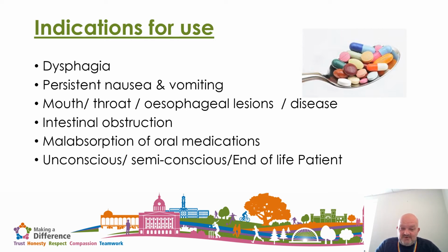And obviously, for a lot of us, we come across syringe drivers for patients at the end of life, where again, they are unable to swallow due to weakness or some physical issue that's stopping them from swallowing their medication. But usually at the end of life, it's very much about weakness and levels of consciousness, and trying to get them to take oral medication is not possible.